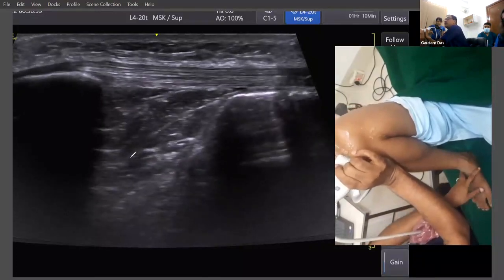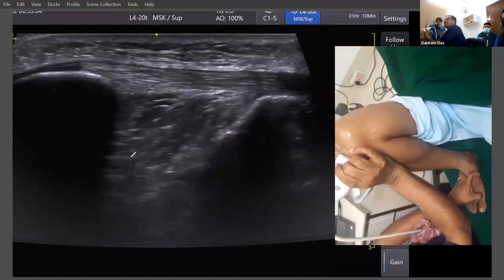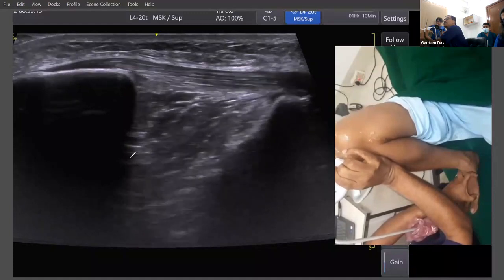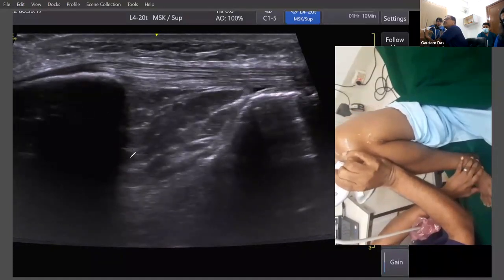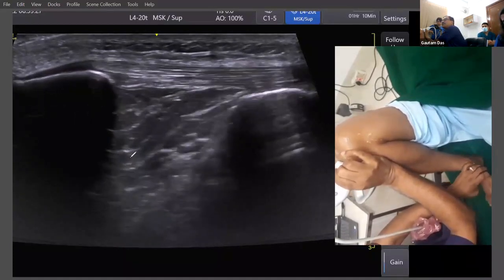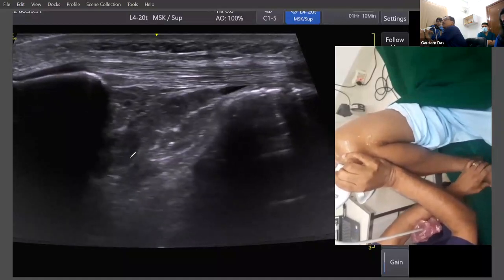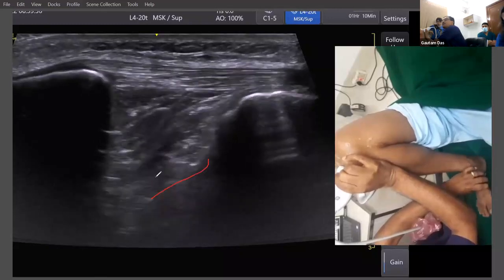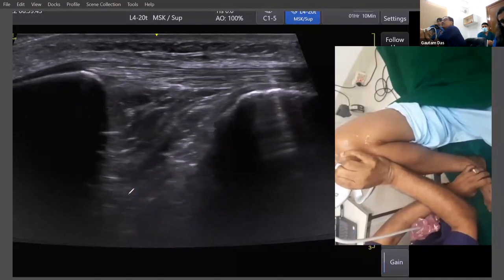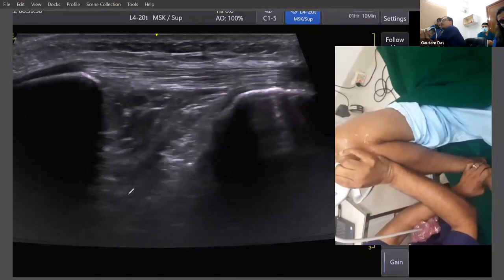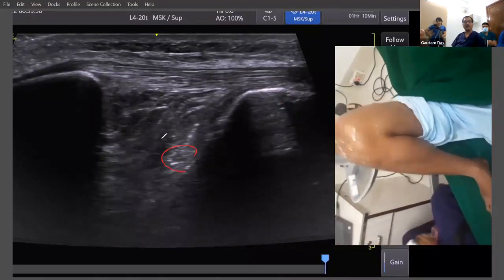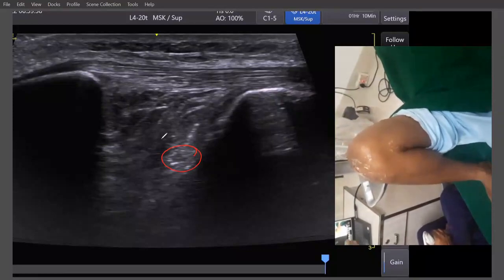Below that hyperechoic intermeniscal transverse ligament is your ACL. Now I'm doing external rotation while holding the probe there — you can see below the intermeniscal transverse ligament we are stretching the ACL. Can you appreciate that? It is becoming a little bit hyperechoic, and when stretched, the big bulky portion all below that intertransverse ligament is your ACL. Now the posterolateral bundle has become a little bit hyperechoic. You can see the intertransverse ligament very nicely, and below that hyperechoic area is your ACL.